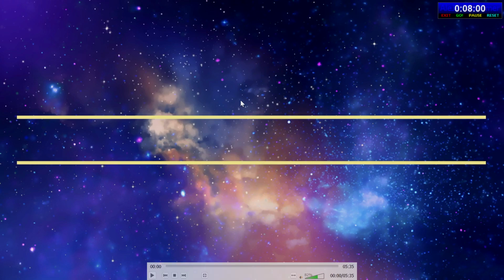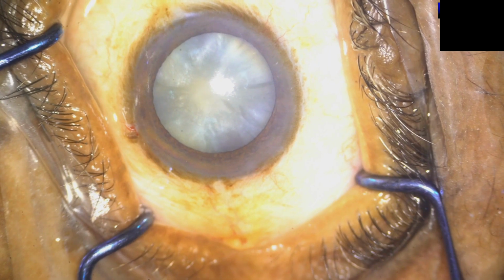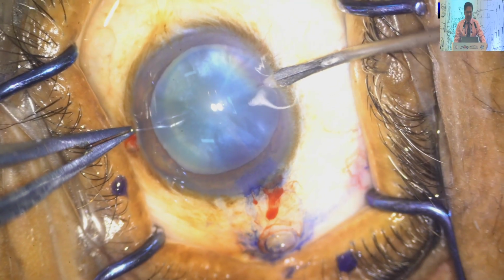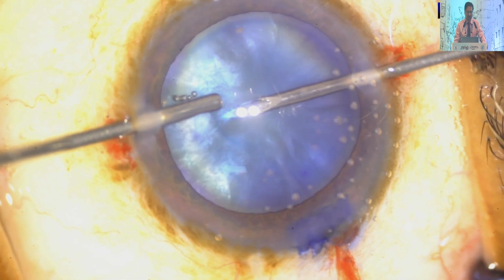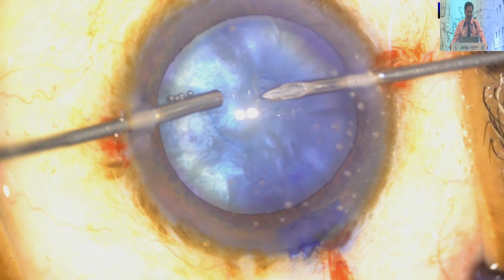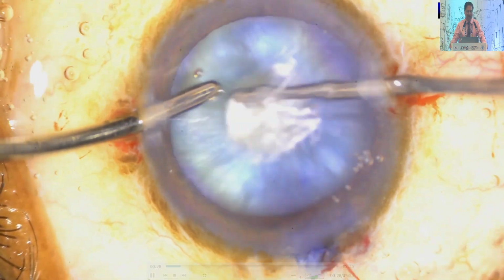Thank you, Chairman. And today I am going to present an innovative technique to deal with intumescent cataract. It's very rewarding. This is an intumescent cataract, white cataract. Then 2 side ports are made. And now the 24 gauge needle is bent and it is penetrated inside the capsular bag to aspirate the liquid cortex, and from the other end simultaneously you are injecting the visco.